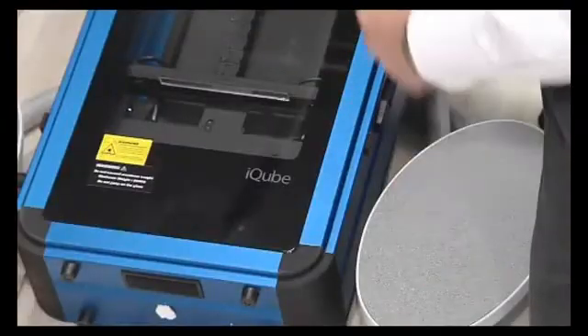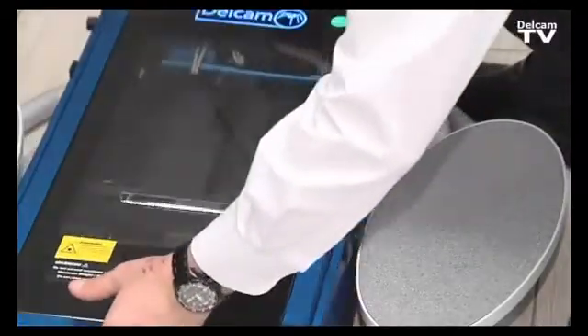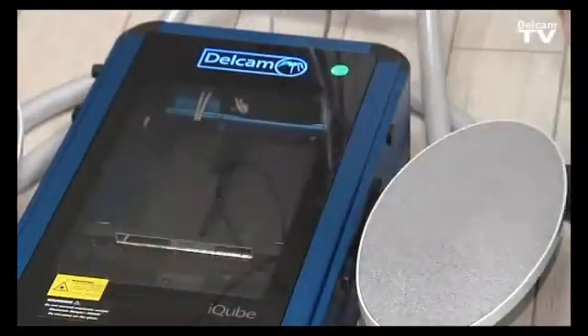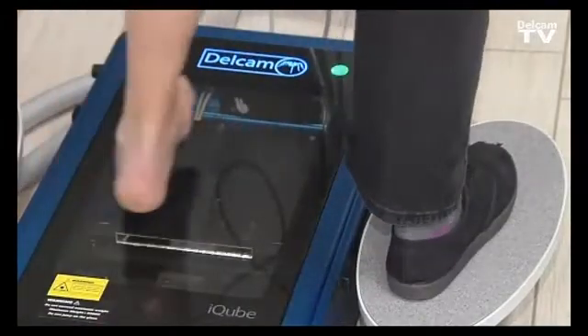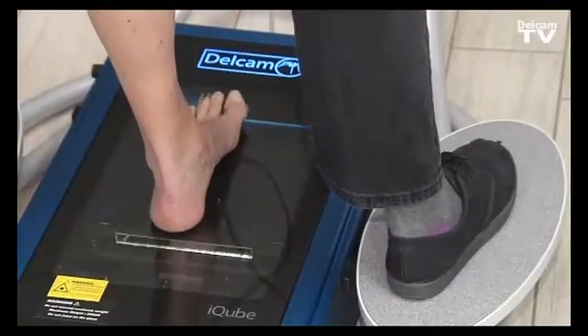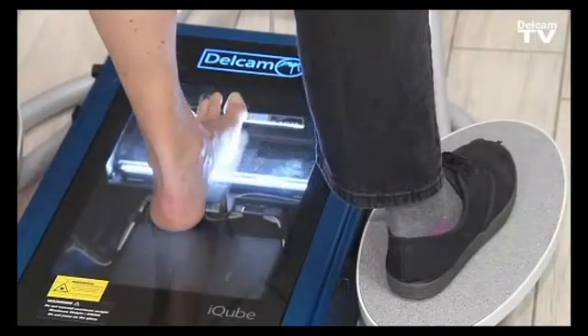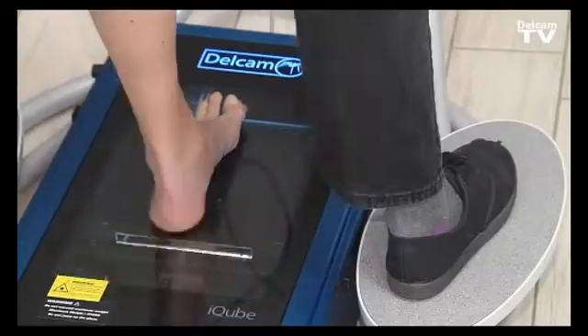From semi-weight bearing, it's very easy to move the iCube scanner to a full weight bearing position by just putting it in position. The patient will stand on the iCube stand, lay the foot in, and we can simply select to scan the left foot while the iCube scanner captures the 3D image of the foot.